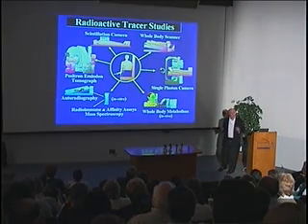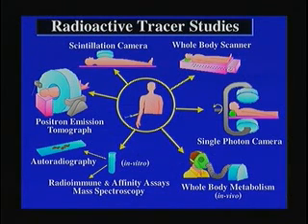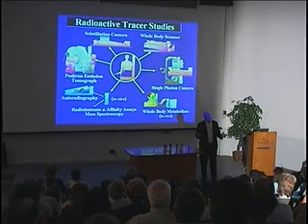These were the various activities done in the 1960s to detect where the isotopes go in the body, some of which have turned out to be very effective diagnostic tools. The scintillation camera, the positron emission tomograph, whole body scanners, tomographic scanners, even ways of measuring the distribution of an injected compound, let's say carbon-11 compound or carbon-14 even, 5,000-year half-life, but at 25 microcuries, not an important dose relative to the natural dose that you get from background activity and your radioactive potassium in your body.